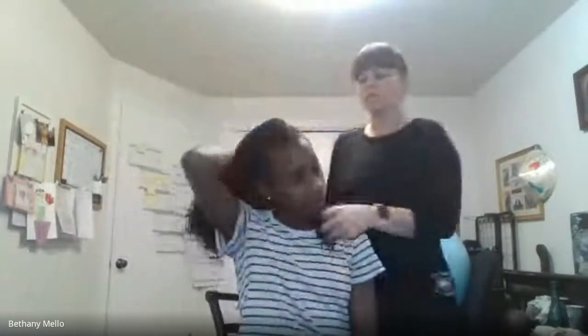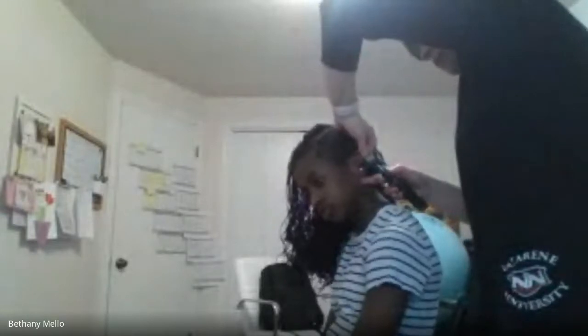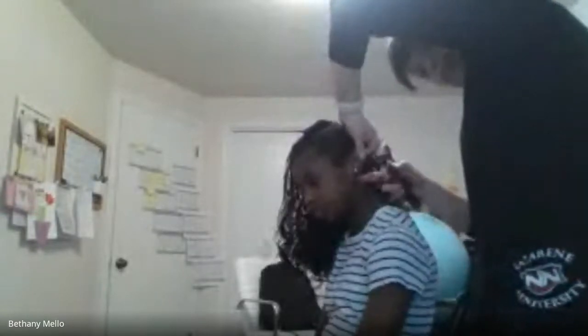And so when you're doing this exam, you can look at both ears first before you report. So on this side, I'm right-handed dominant, right? So I'm going to look a little awkward. And if you look here, my finger now, instead of being on her chin, it's back here on her neck. Same thing though, she moves her head. It's not going anywhere because I'm supporting it.